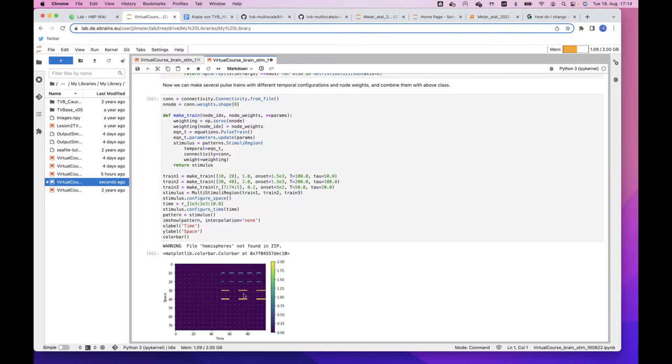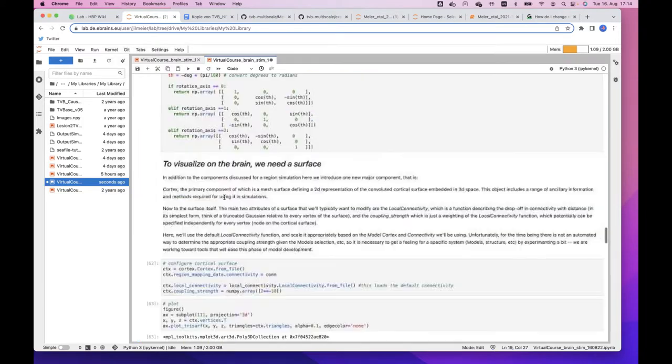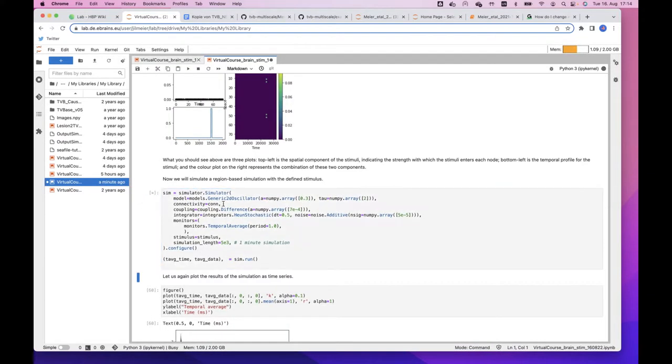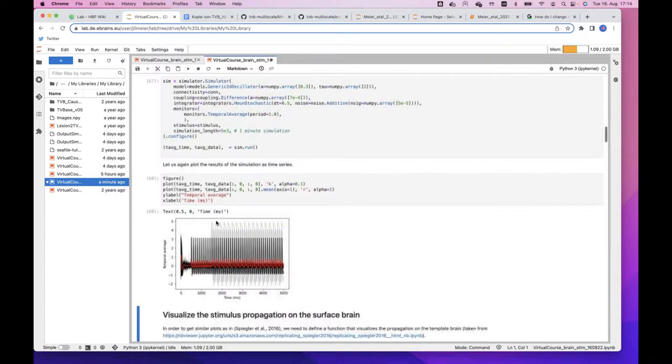And then you can go and get even crazier if you say, I'm not satisfied with one stimulus. Because there are two DBS electrodes, I want them to send different pulses at different times, for example. So let's define the class multi-stimuli on different regions, which is already part of the TVB toolbox, but I put it here so that we can see it. And let's again load our connectivity. And then let's make different trains of stimulus. You see here is a green one and a yellow one. And they will be put on different regions. So two regions will receive this pulse, pulse, pulse, and two others will receive much shorter pulses.